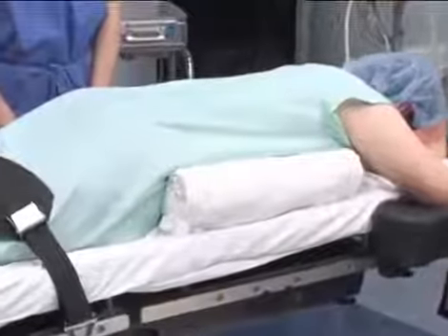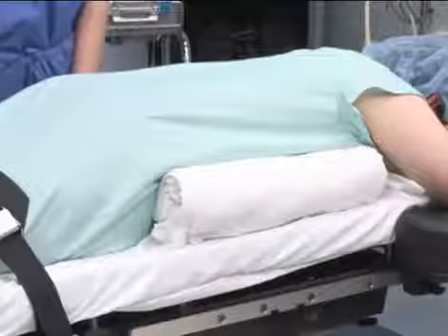In the prone position, the patient's upper body rests on a raised padded frame or elongated pads placed on each side of the patient's thorax.